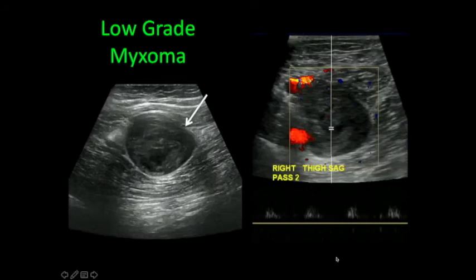So they then went to ultrasound, and here you can see this very round but heterogeneous mass, and with careful interrogation, we were able to show that there was flow within this mass. So we've got an arterial signal here. And also, if you notice, there's a lot of mass effect on the adjacent muscle, more than maybe you would expect for a fluid collection. So this turned out to be a low-grade myxoma. And these tumors are a really major mimic for hematomas. I've seen more than one of these now, and you have to really be careful to use low power settings and low flow settings to look for color Doppler. But we were the modality that first was able to show that this was a mass, and we subsequently biopsied it, and then they had it removed.